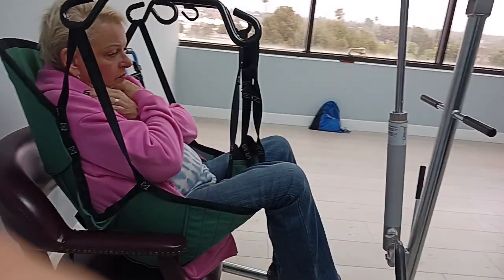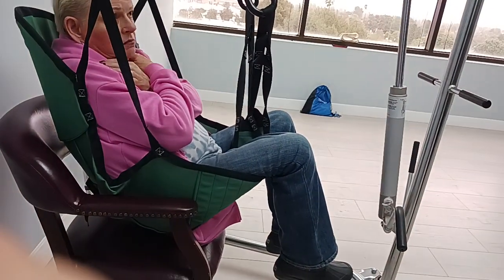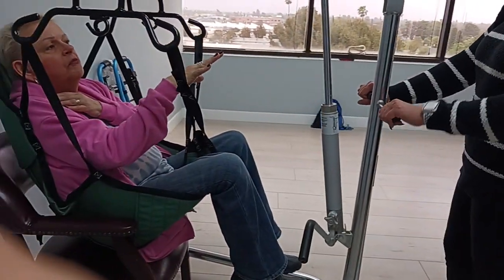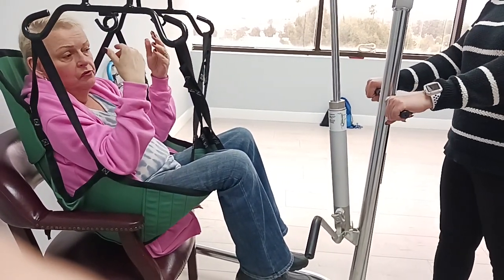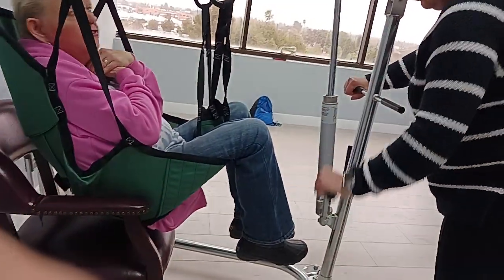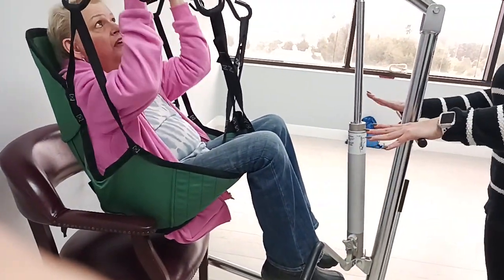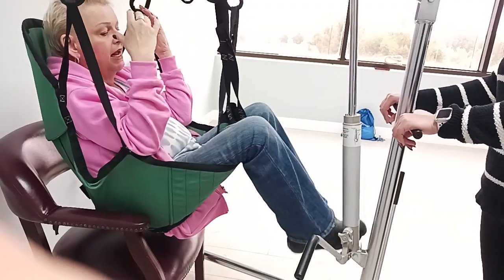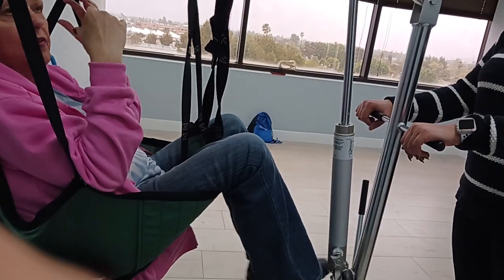There she is, off the chair. We would do a lot more if we're actually transferring — we're not really moving her far, but this is how they would be. They would be lifted. Let's pretend like we're going to put you on the toilet, so we're riding over to the commode. This is an intimidating machine, I know — because they're swinging midair. You have to be very cognizant of not hitting their legs on doorways and things. It's very common to get skin tears from getting legs hit on the way through.